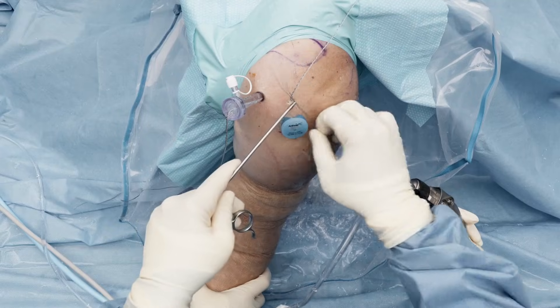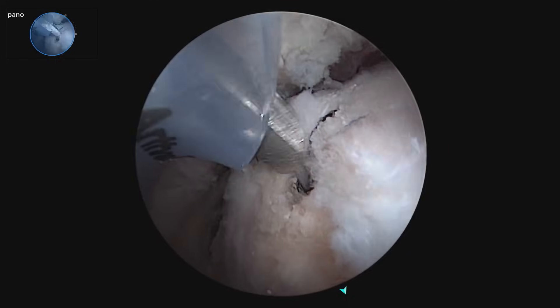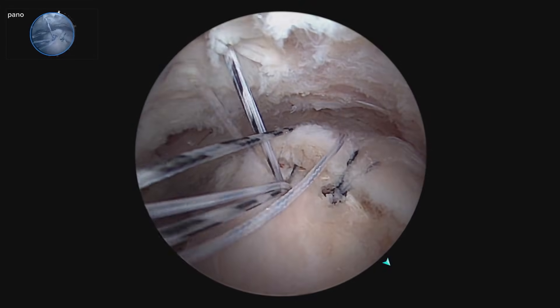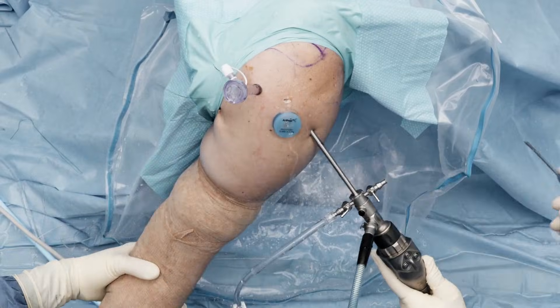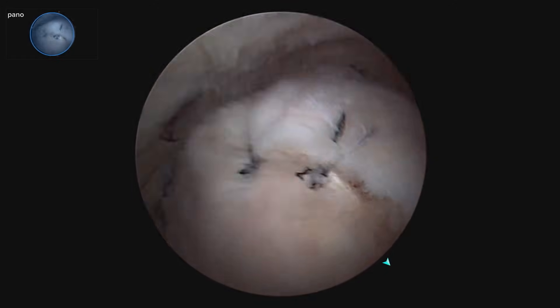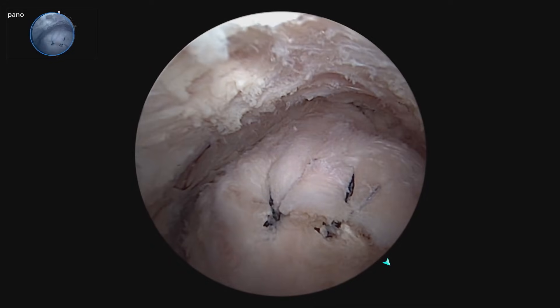We will go ahead and use the mega loader to load our repair sutures in the cutter. We'll come in, go down to the anchor, and give another little gentle tug. Now we'll do the same thing with the other sutures. That's perfect — we will cut this suture. We've got this single row, lateral row repair of the rotator cuff with great fixation of the cuff tissue to the greater tuberosity.